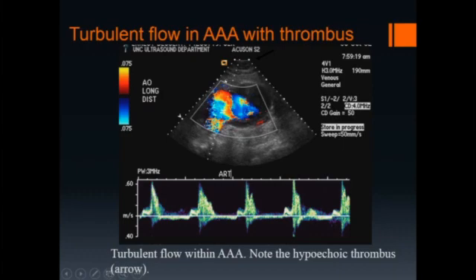In aneurysms with thrombus, turbulent flow can be seen with Doppler. On this image, we see an abnormal aortic waveform with turbulent flow and spectral broadening. The color Doppler image shows turbulence, while the thrombus itself is markedly hypoechoic and not well seen on the grayscale portion of the image.